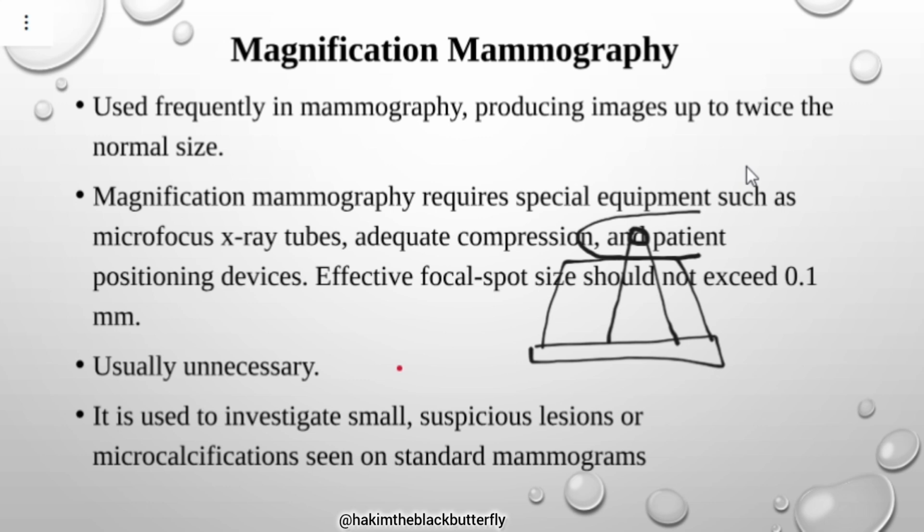Sir, excuse me. Yes. I think the lady was asking whether mammography only deals with breasts. Yeah, I think I've already answered that. Salome Faith asked that question, and I answered. It is only designed for breasts, not any other. It is for breasts. Nalia Justin, what's your question?